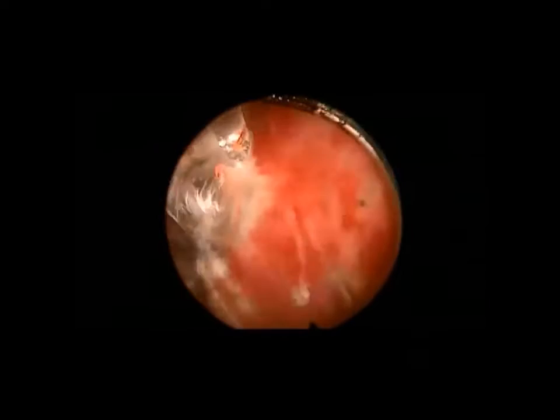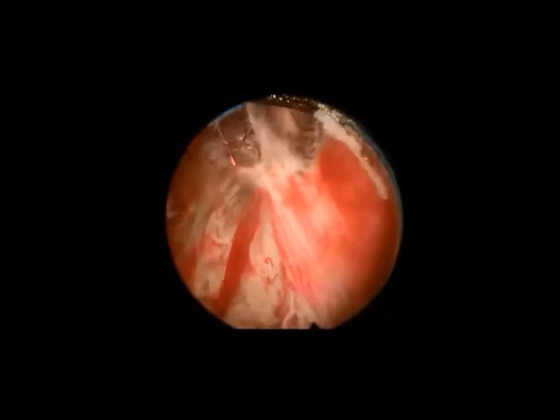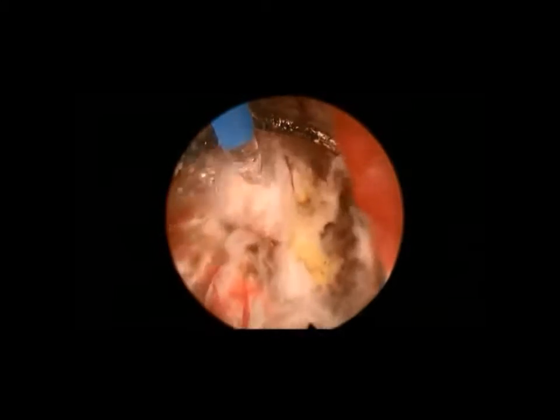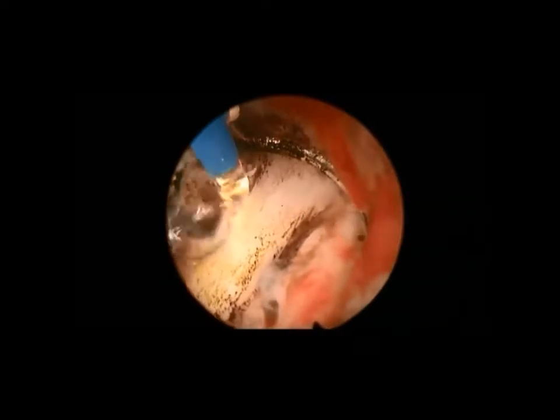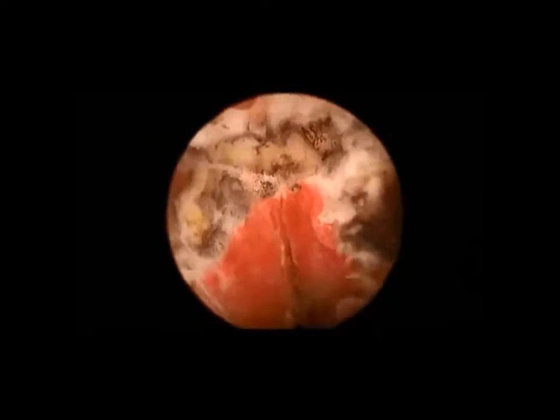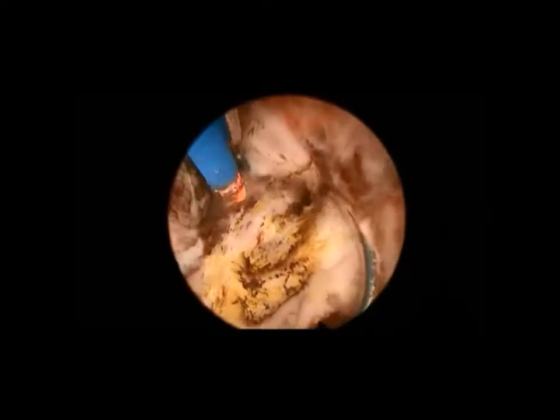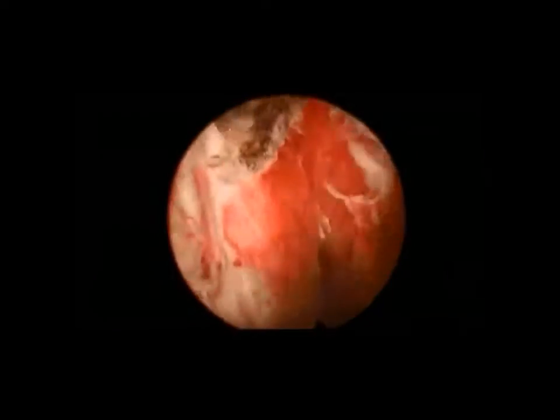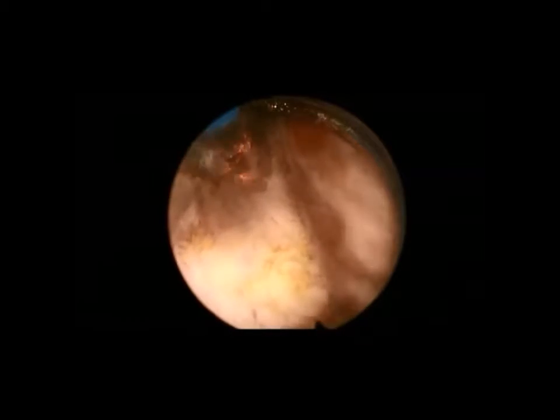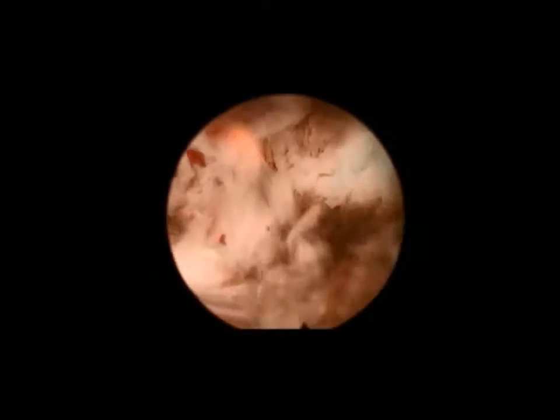Here we are on the right side, going from lateral to medial, incising near the adenoma rather than near the sphincter. And one can see the anterior commissure coming up shortly just below the laser, right there. We want to complete this incision from right to left and left to right to completely free that anterior mucosal strip. Subsequently, we want to divide all of the anterior attachments to release that anterior prostate.